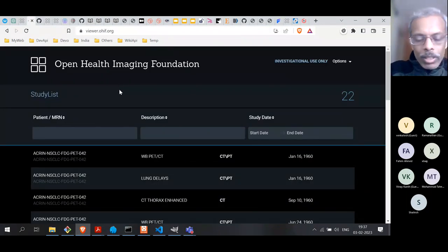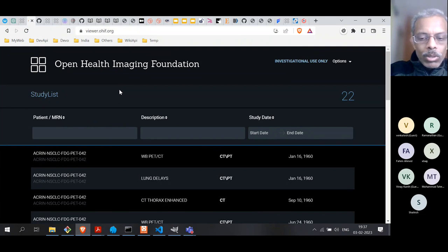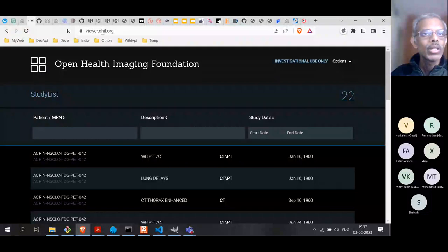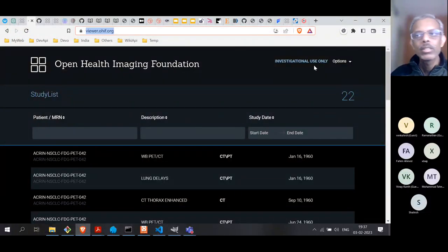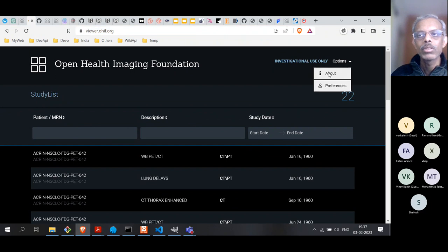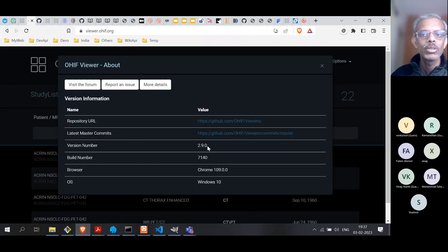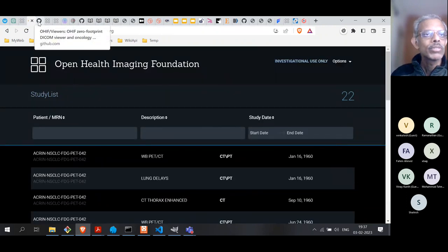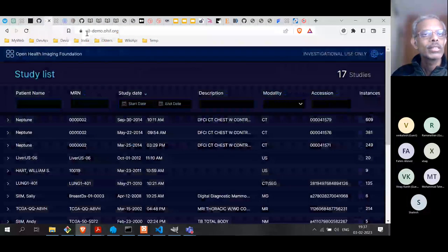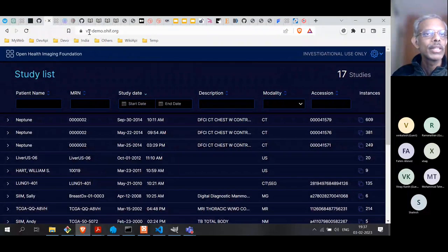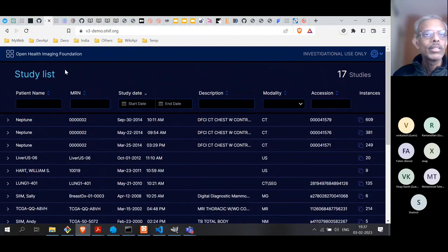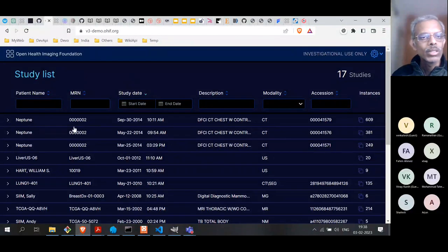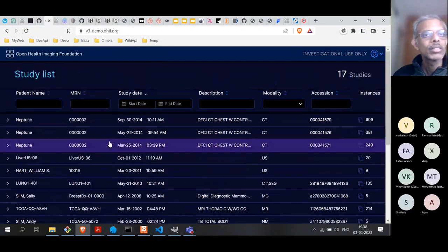It so happens that this particular software already has a demo running online, accessible at viewer.ohif.org. This one is using an older version of the software — version 2.9.0. There is also a newer version running online at v3-demo.ohif.org. This is the updated UI. Let's look at the demo on this one rather than the previous version.